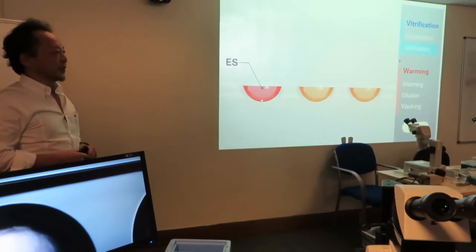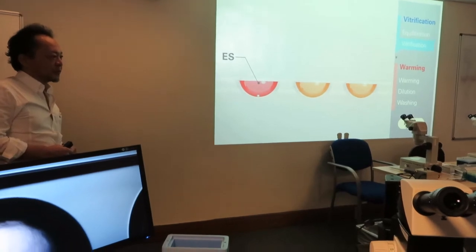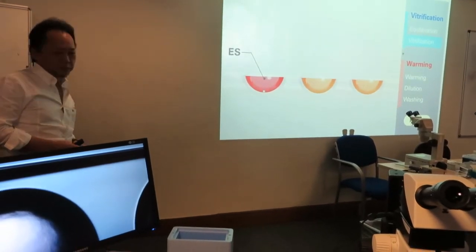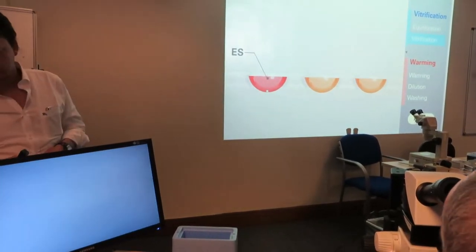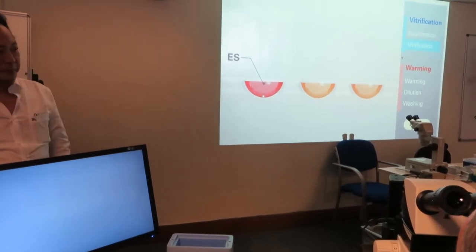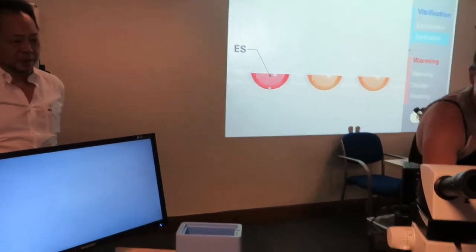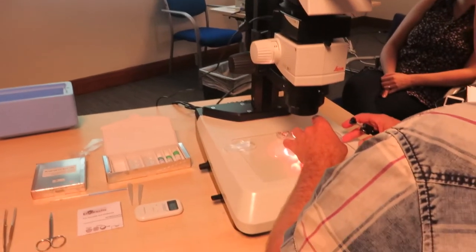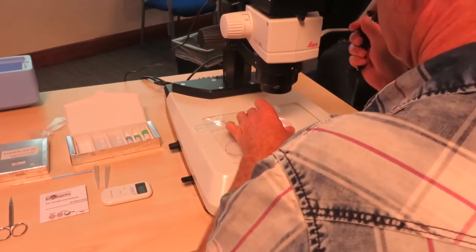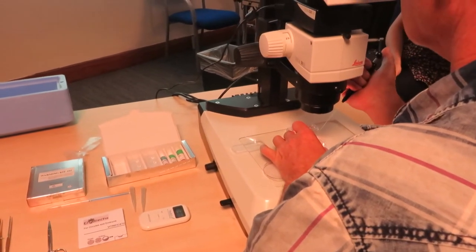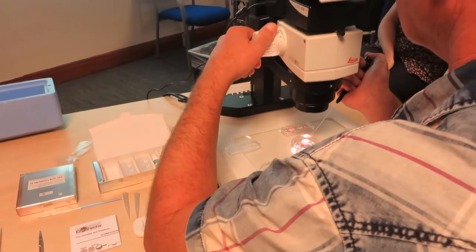After eight minutes, you watch and observe the recovery and then wait. Normally, the average time required for oocytes is about 12 minutes. If you have no confidence of recovery, the oocyte never recovers. The limit time is 15 minutes. So we judge full recovery or 15 minutes. This is the first step. Let's do it.